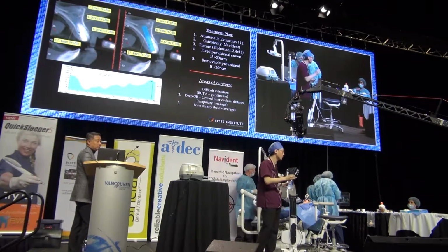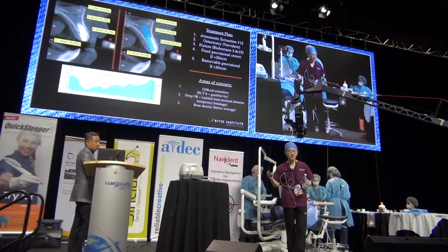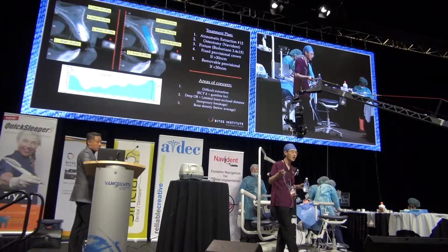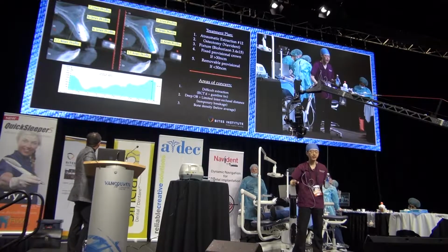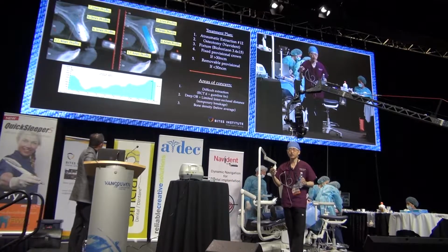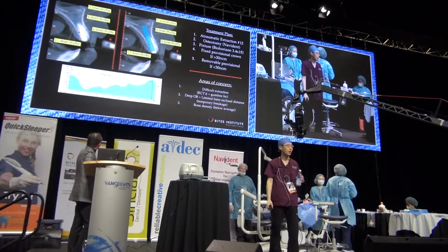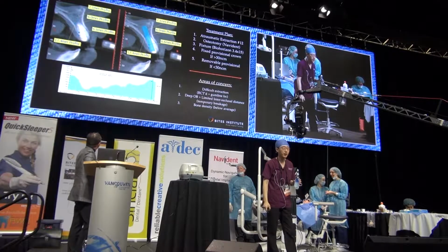One of the most underappreciated values in CBCT analysis is the density of the bone. Medical colleagues call it Hounsfield value. So if you look at the bottom screen, there's a graph. What does that tell you? Along the path of the implant, the bone density changes. So what we're hoping to look for is a Hounsfield value of about 400. What do you see here? A dip down, right down to 134. Is that a good thing or a bad thing? It's a terrible thing.